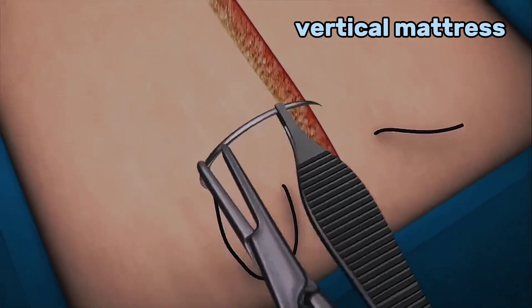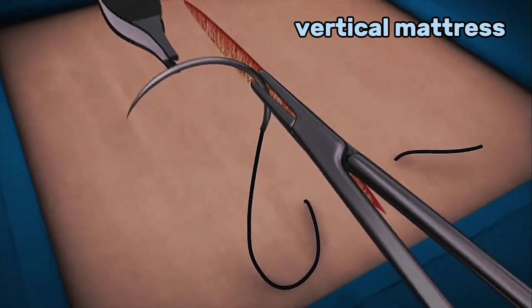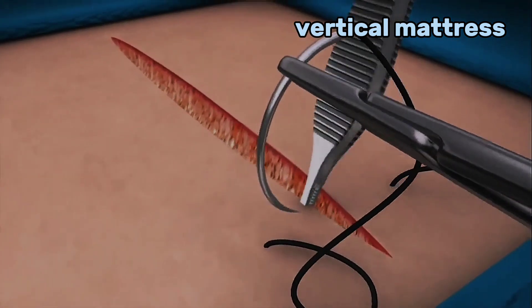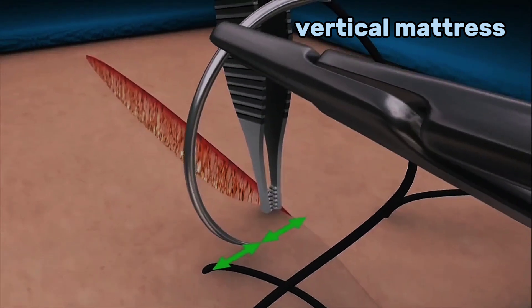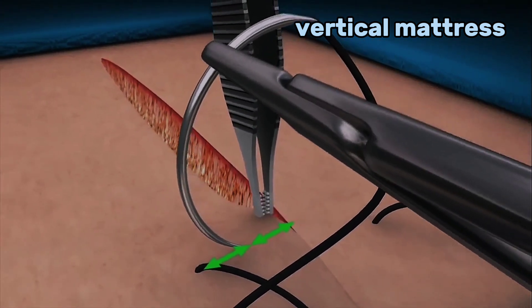Hold the needle with the forceps and rotate it in the needle holder to prepare for the backhand part of the mattress suture. Now take a small bite approximately halfway between the exit point and the skin edge.